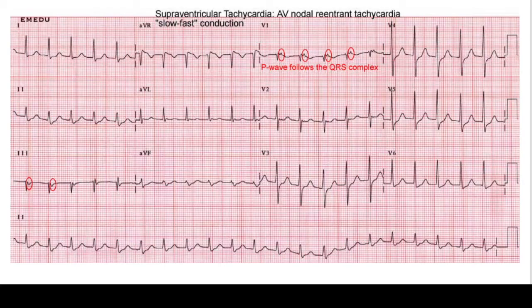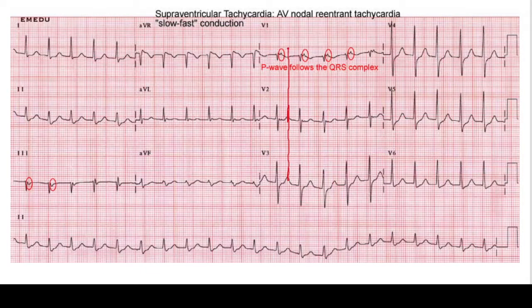Here's an example. Looking at V1, we have some retrograde p-waves nicely circled. You see the QRS complex, and then a little bump right after it — that's the p-wave, not the t-wave. If you look at the rhythm strips below in V2 and V3, you can see the t-waves there. Lining them up, the negative deflection in V1 is probably the t-wave, and this positive deflection is the p-wave — a retrograde p-wave. This patient's heart is going at about 150 beats per minute. It's regular, narrow, so it's a regular narrow complex tachycardia, and because it has retrograde p-waves, you know this is an SVT.